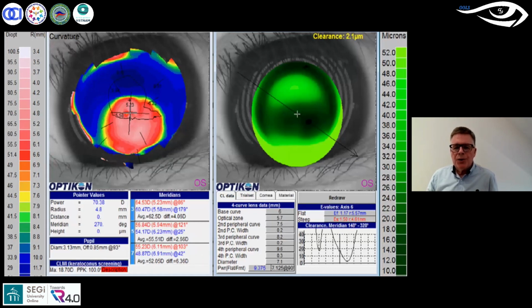Now, apologies, you may have seen this image before. I've used this image a number of times over the years. This is an image of a keratoconic patient on first diagnosis. This patient had no idea that she had keratoconus other than there was a visual disturbance. And as part of the BCLA, we took this image to a number of conferences, both in the UK, the Middle East and the Far East, and we invited experienced practitioners to fit this particular eye with rigid gas permeable contact lenses.